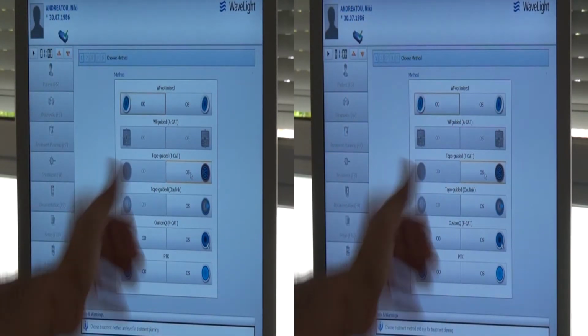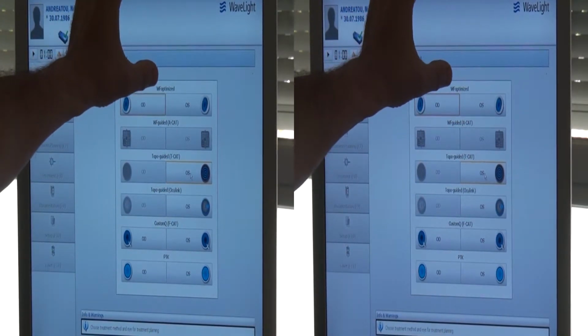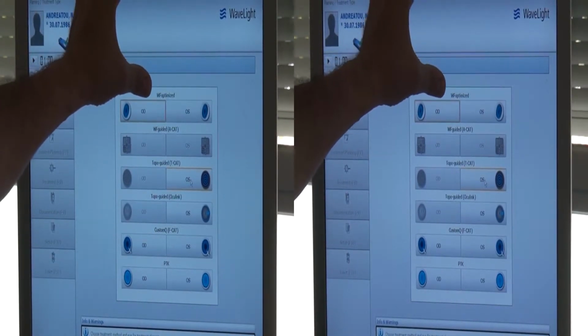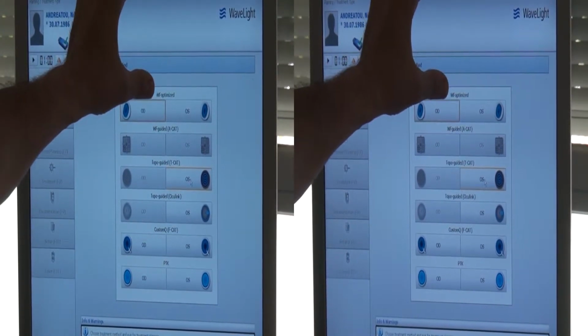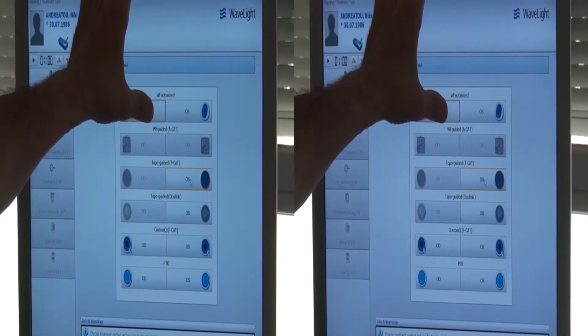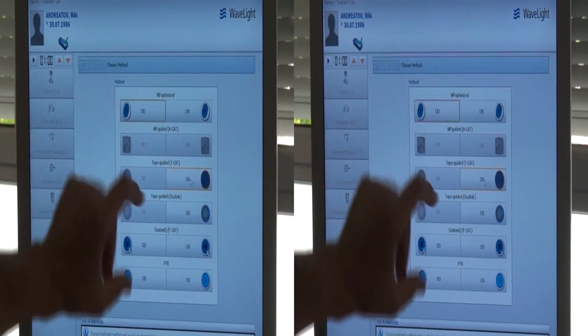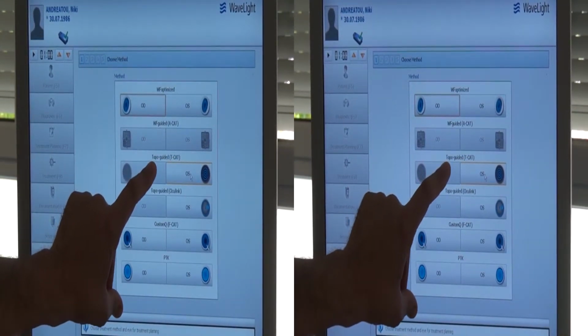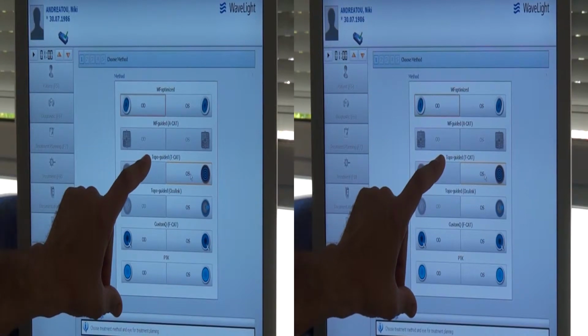You can see all the options. As I mentioned, we have the wavefront optimized, which probably is excellent for the majority of regular myopic patients. Then we have wavefront guided, which is a very fine tool to modulate potential wavefront aberrations, such as coma, etc. Then we have the topo-guided TCAT, which is basically a placido disc-based topography guided.